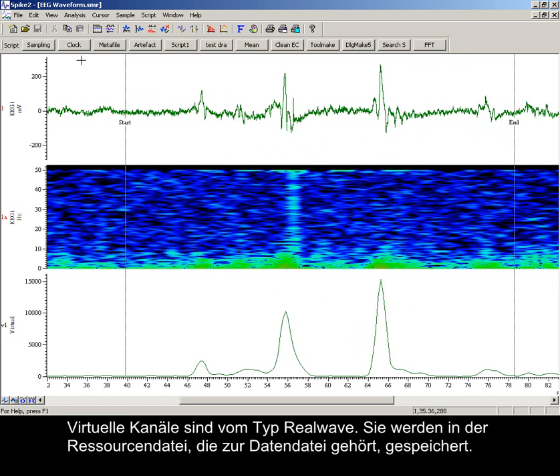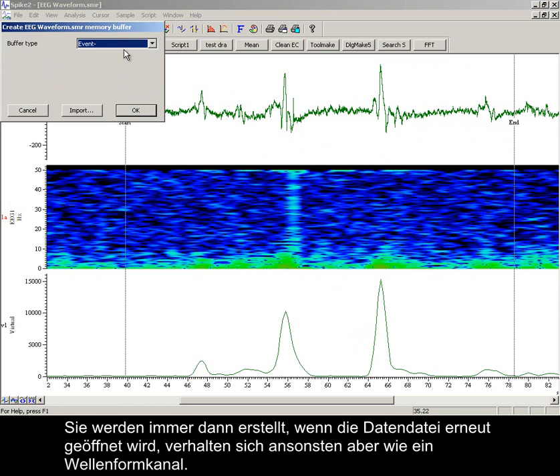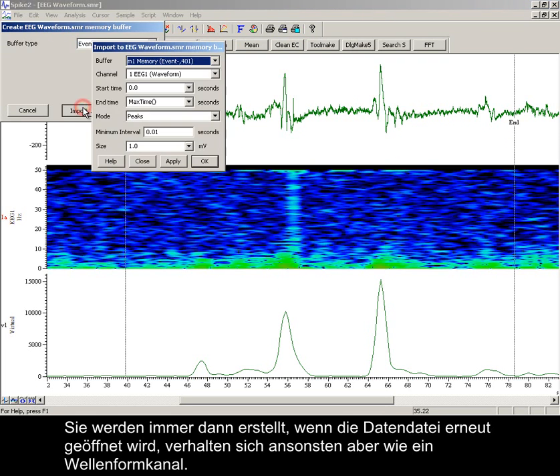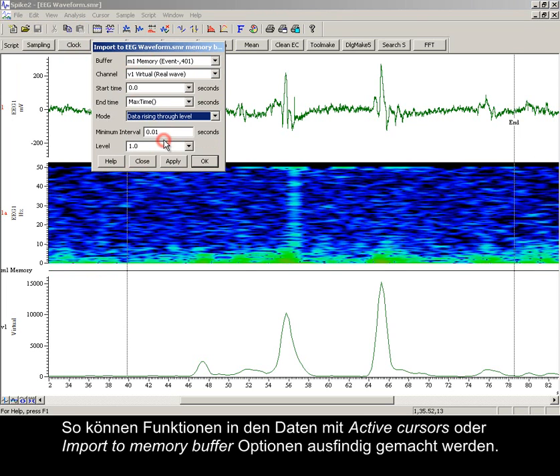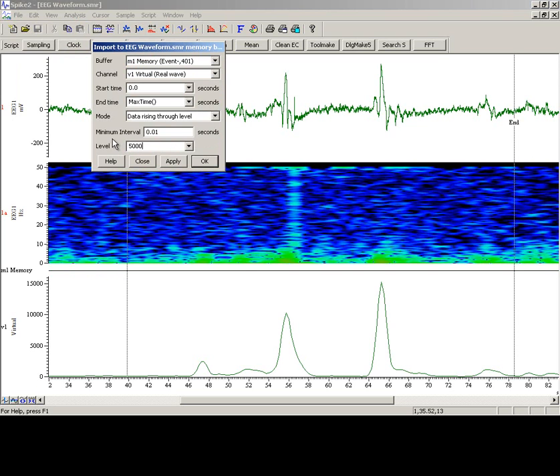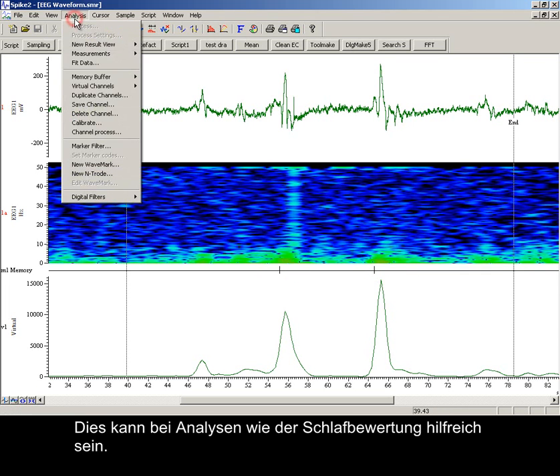Virtual channels are of the real wave type. They are stored in the resource file that accompanies the data file. They are created whenever the data file is reopened, but otherwise behave just like a waveform channel. Because of this, it is possible to locate features in the data using active cursors or import to memory buffer options. Here we are marking every upward stroke exceeding a level of 5000, which can help with analysis such as sleep scoring.